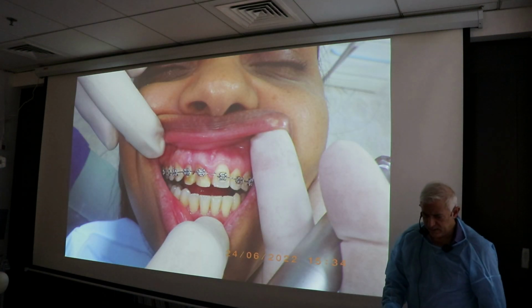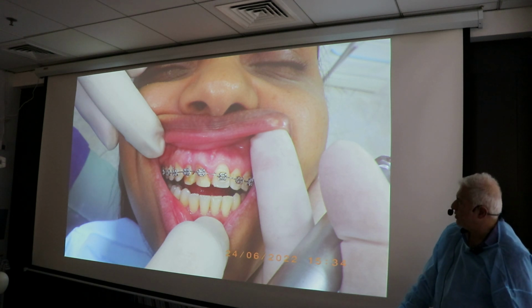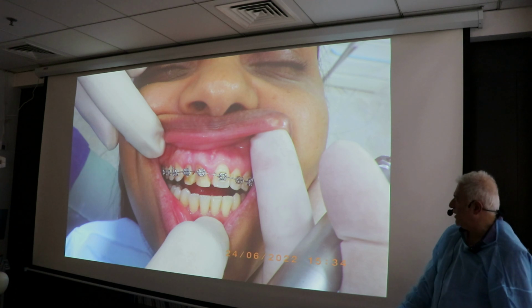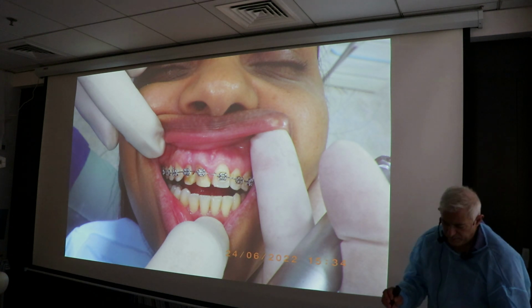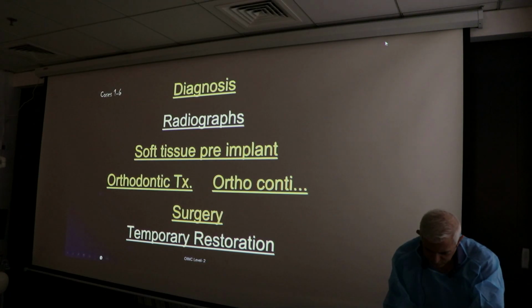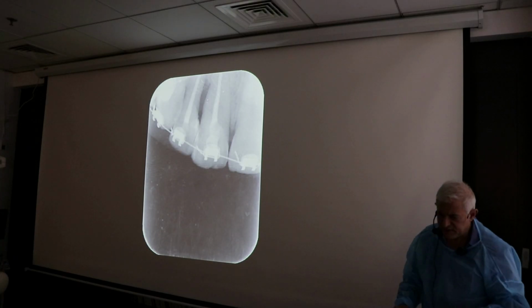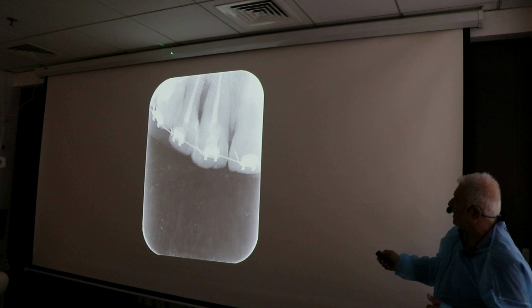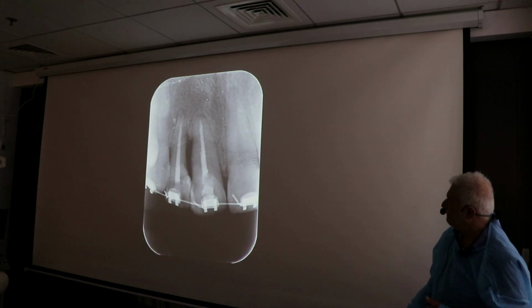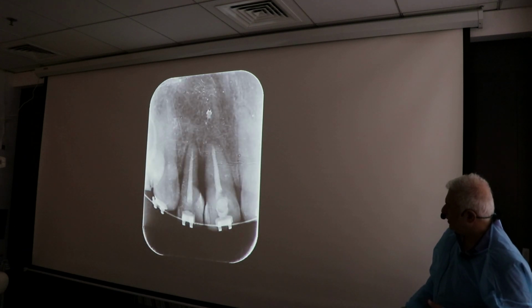Now it's a time that the orthodontist said, I think if I continue, the tooth is gonna come out. So you might as well get in there. Before I go there, I wanted to show you some x-rays before I'm so brave to go and extract those teeth. So this is at the time when we place the bracket, right? You can see the amount of, we are pulling it downward. This is actually being pulled.